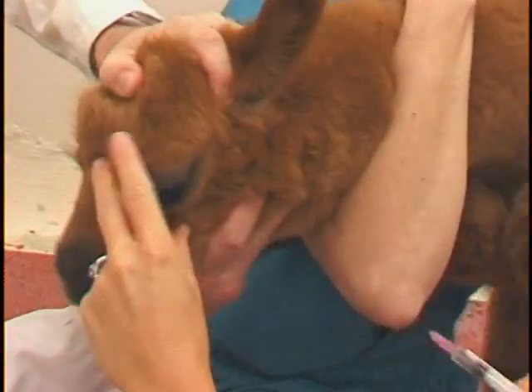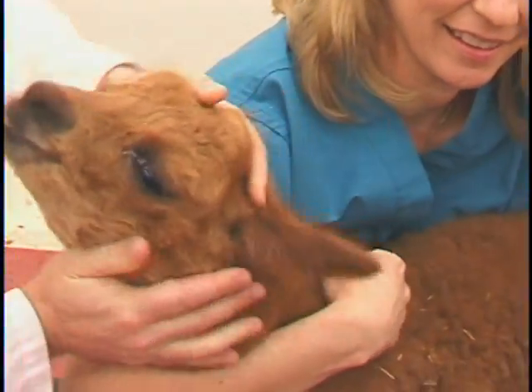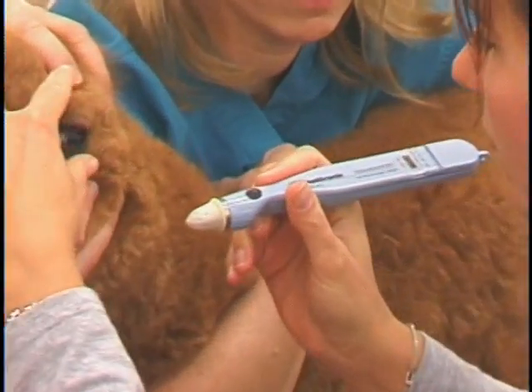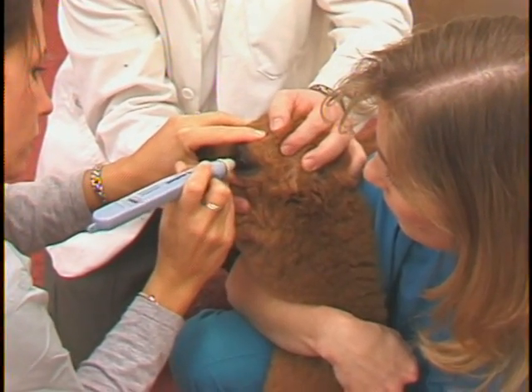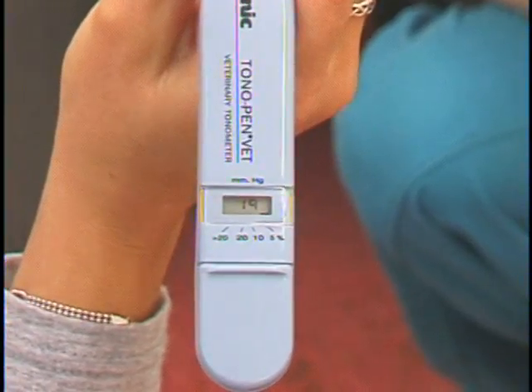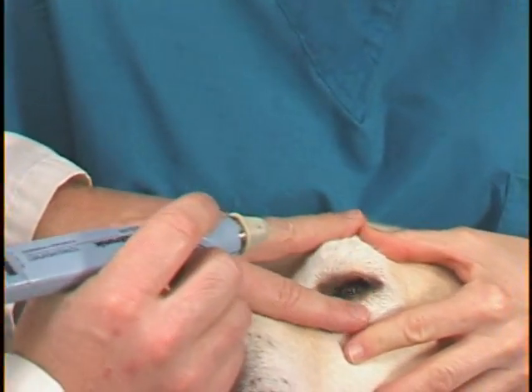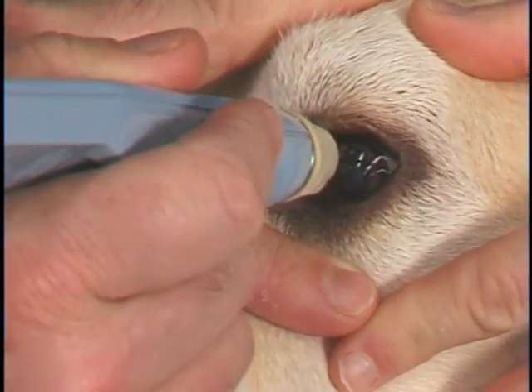Use of the Tono-Pen has increased veterinarian awareness of intraocular pressure and resulted in early referral of small animals with glaucoma and a great increase in the frequency of diagnosis of equine glaucoma. The ease of use, accuracy, and comfort level this tonometer gives your practice will ensure its frequent use, increase your hospital's awareness of glaucoma, allow early and prompt referral of glaucoma patients to a specialist if indicated, and subsequent referral of your glaucoma patients back to your hospital for monitoring following laser or other glaucoma surgeries by a specialist.